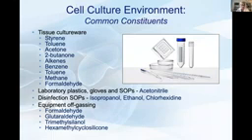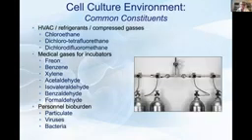Even new gasketing that you may use to repair your equipment can continue to off-gas for months, if not years. Your refrigerators, your freezers, as they're going through their compression process to maintain temperature, can release VOCs. Medical gases: we ordered, at that time, the highest quality medical gas, called research grade. It was the most expensive, but still had a large number of VOCs concentrated, especially as you would continue to use the tank. And then we shed: the embryologist, the clinical team, patients.